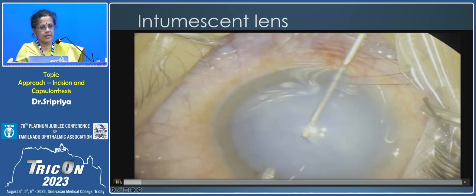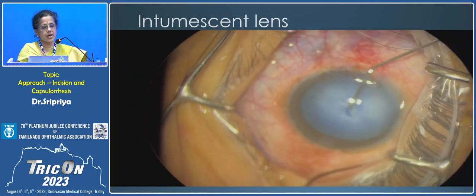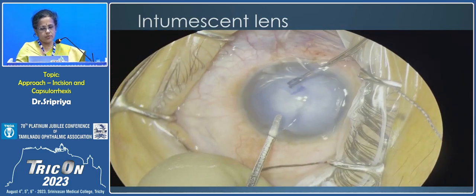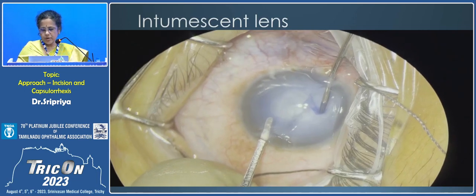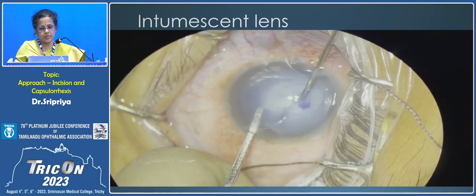And the initial nick has to be very small, and then you use a saline cannula to aspirate out the hydrated cortex, and then either use a micro forceps, like in this case, or an Utrata to complete the procedure. When you use an Utrata, you have to use the main wound, whereas in a micro forceps, you can continue with the side port, so you have a better chamber formation.